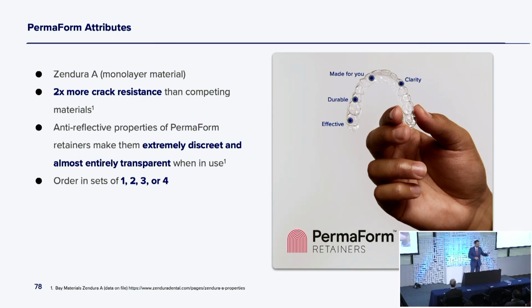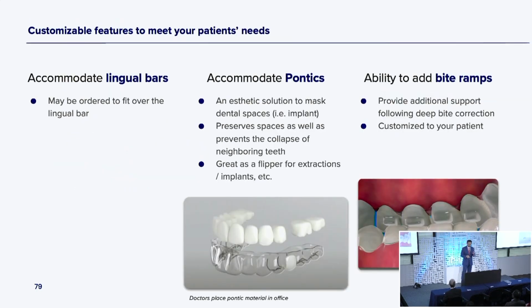If you were going to be going into some significant crown and bridge and implant reconstructive type stuff, you might only make 1 or 2 to juggle between while you're doing your work. And sometimes with crown and bridge and implant reconstructive stuff, you might actually do a quick vacuum form in the office because procedures might be happening within weeks. And you're not trying to purchase aligners that are retainers for a few weeks, then the next one, then the next one. So I make a few in the office along the way to handle the restorative needs. So the retainers, very nicely done, 1 year each, 4 years total given out.